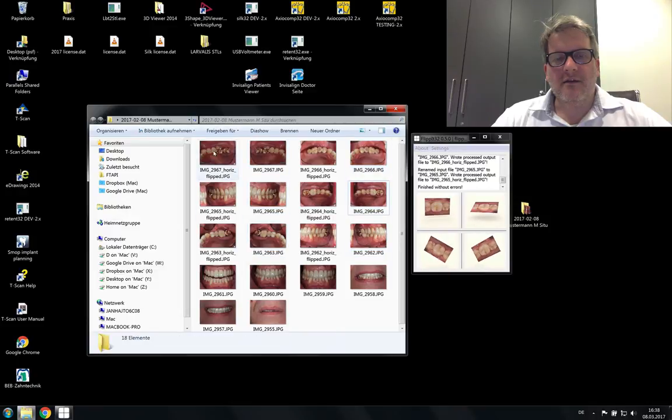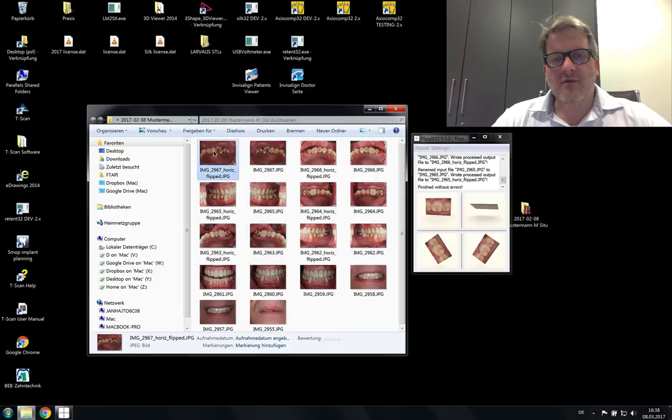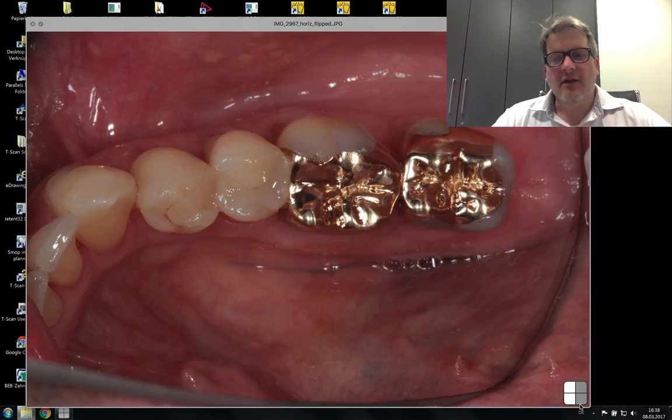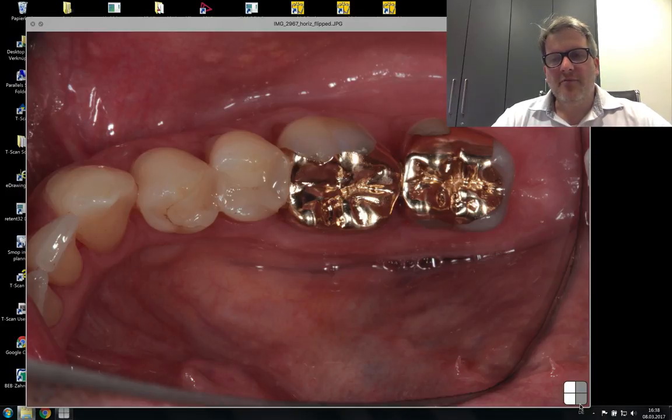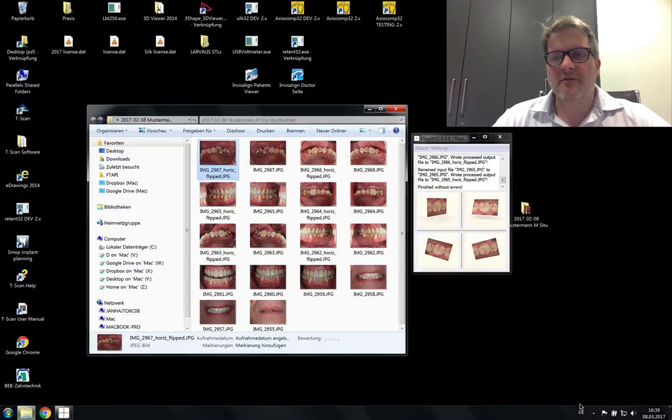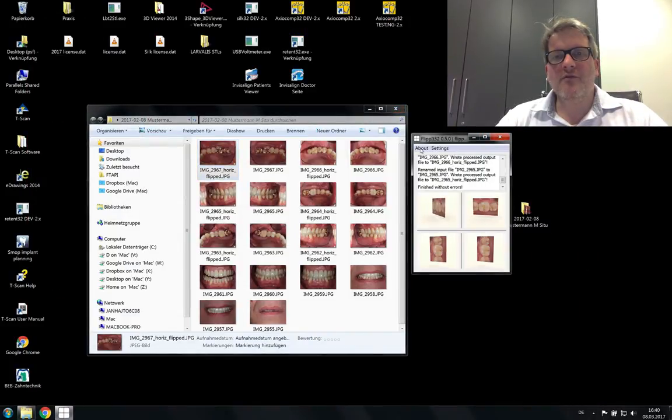And another feature when you look at this image. Here in the lower right corner a small icon indicates that it has been flipped by FlipIt. So you always know if it's still the original image or if it was un-mirrored.